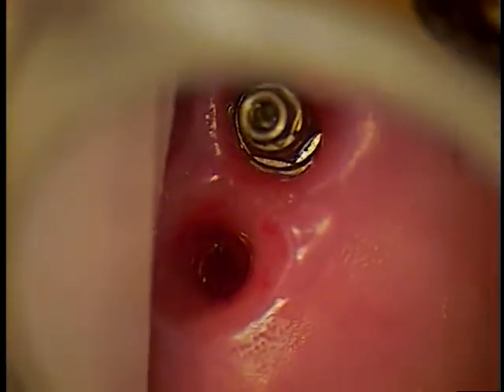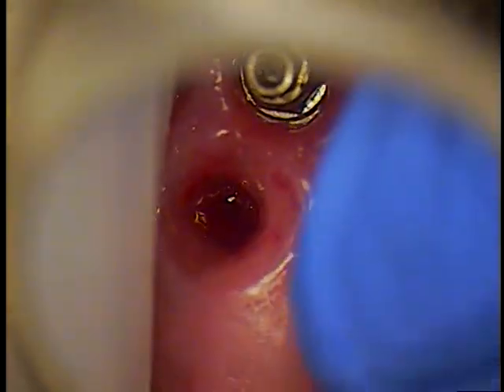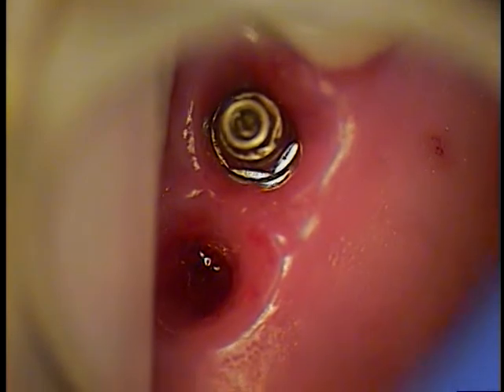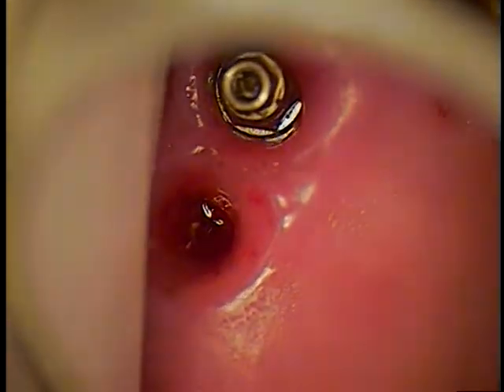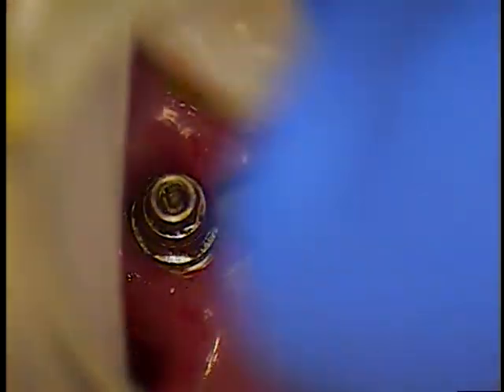So the other answer to your question is I really can't put this bridge back in today. I would have liked to, but that other implant, the head of the implant is fractured off completely. So let the tissue just close over. It's going to be fine. It's made of titanium, so it's built for the body. We're just going to go in on this one.